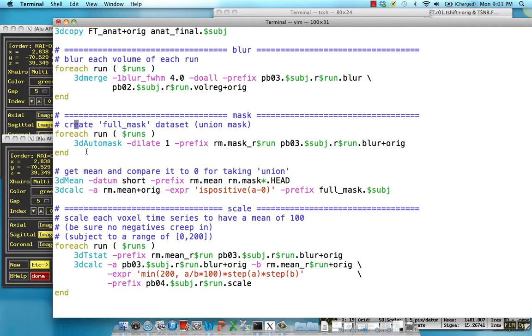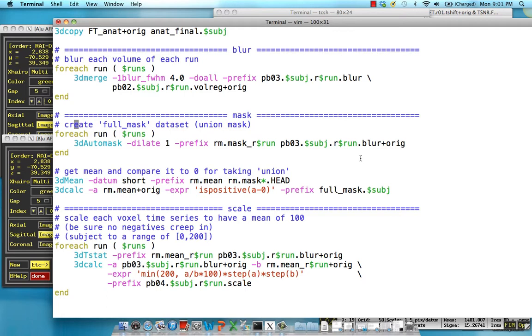It's created with this command 3D auto mask, and this dilate is just to make extra sure that we actually get the brain. If it starts to go into air a little bit to space outside the brain, it's okay, but we dilate this mask by one just as an insurance. We do that for each run, and we just apply it. It tries to calculate where in this blurred data set does it seem like there's actual brain and where's the boundary between that and non-brain.